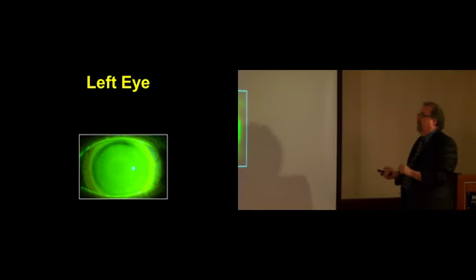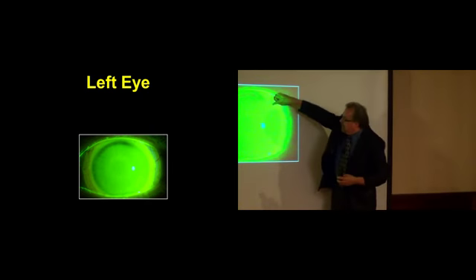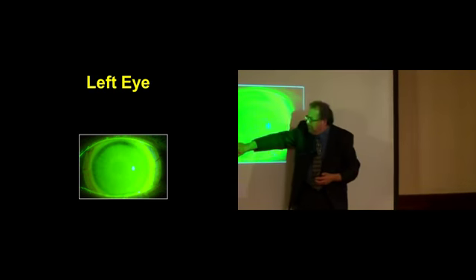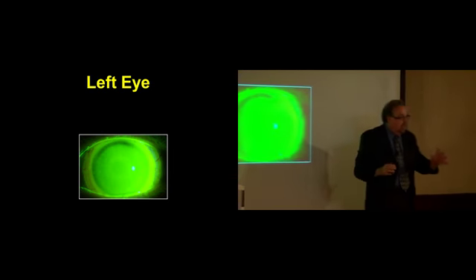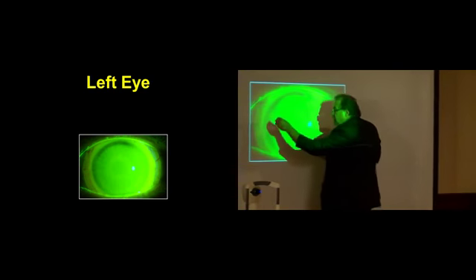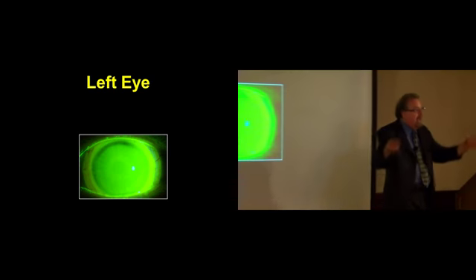So here's a great example of this. We see a patient's left eye. We see we've got nice limbal clearance on this side. However, we're seeing a little bit of thinning superiorly and over on that nasal side, because remember, when the lens is applied, it's going to come in contact first on that nasal side. Now, don't panic.